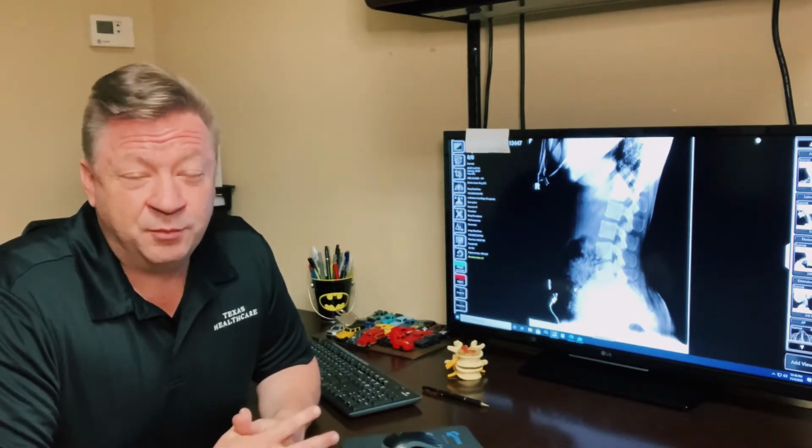And a part of that is making sure we take very good x-rays. Each of us in our clinics here, we have our own x-ray machines so that we can have that study done on the first day that the patient comes in. Sometimes a patient will come in and they've been to the hospital and they've had certain x-rays taken. Some of those x-rays are great when you're looking for fractures and those type of things. Some of them aren't as helpful because the hospital will have the patient laying down. It's important that we get weight-bearing x-rays where a patient is standing up and we can see the posture, because there are misalignments and things that can shift and move when the patient is standing.